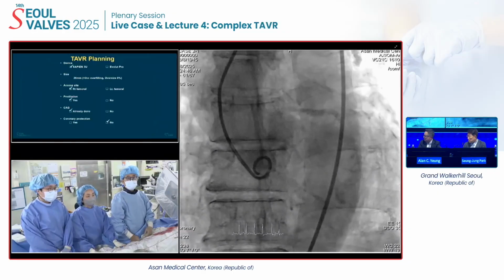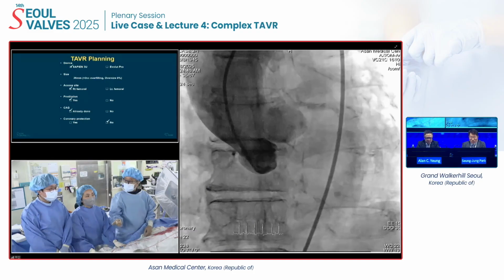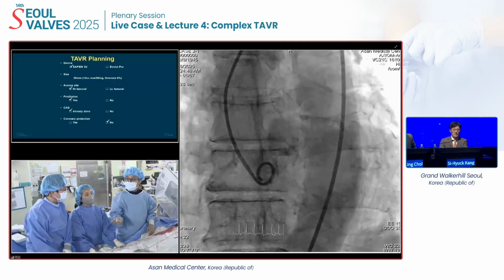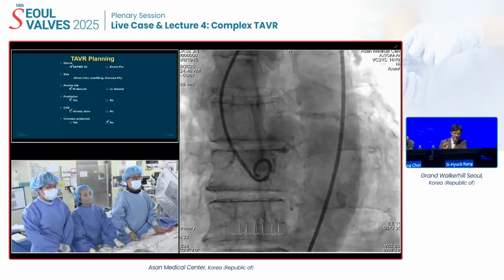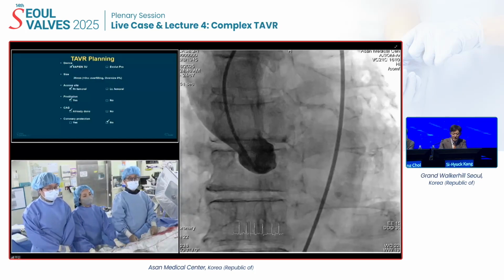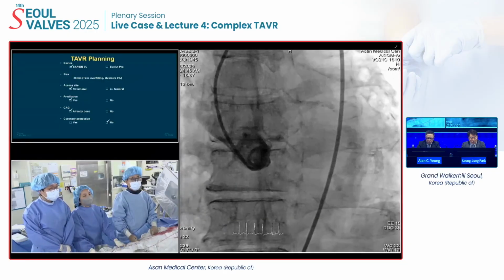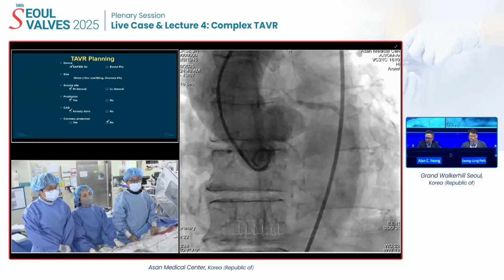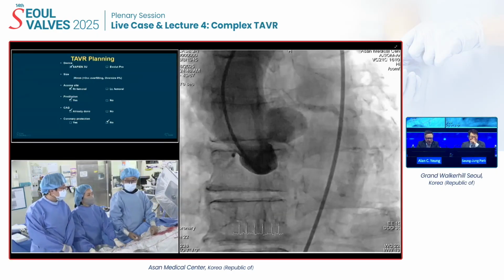it looks like there's heavy calcification over the coronary system. How is the patient with coronary artery disease? Coronary artery disease was mild. We checked with coronary angiography. Yes, mild disease. Actually, the septal hypertrophy is severe. Is there any dynamic obstruction, any outflow tract obstruction because of the septum? No.